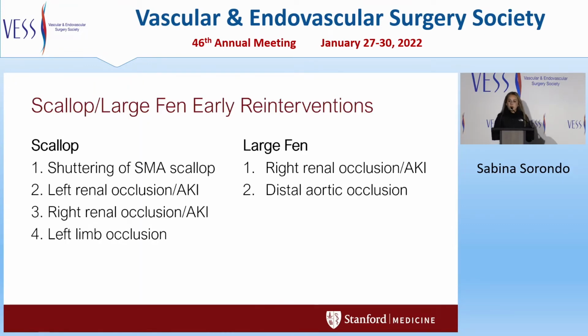Listed here are our total early reintervention rates. As you can see, we did have one patient that had shuttering of the SMA scallop that eventually underwent a covered stent. The rest of these interventions were all repaired successfully, mostly with endovascular techniques.